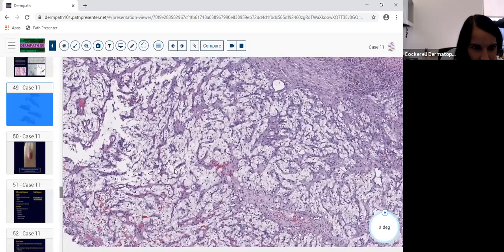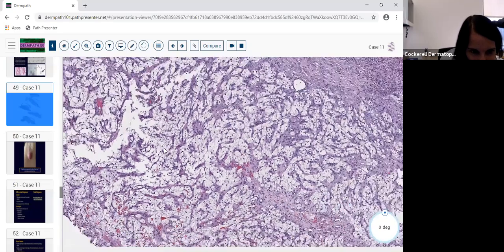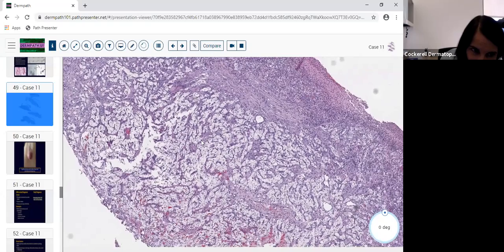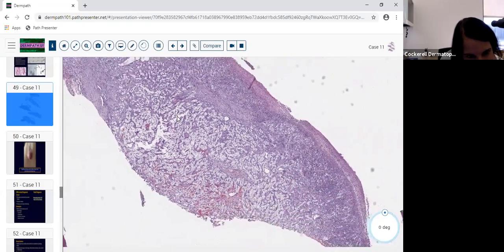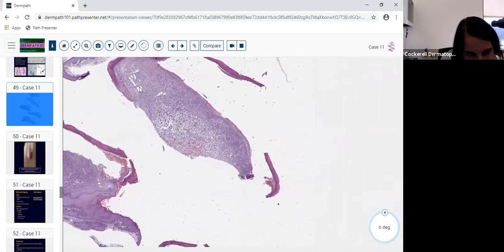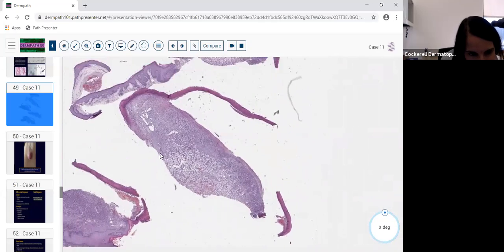If you miss this very arborizing vascular stroma and these packets of cells, this acinar look of the cells. Now, you don't see true gland formation here, and you definitely don't see ducts. And it's one big lobule. If you go on low power and back off it again, you're not seeing multilobulation, and you're seeing these vessels here.